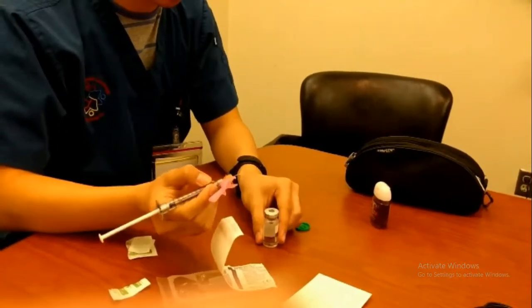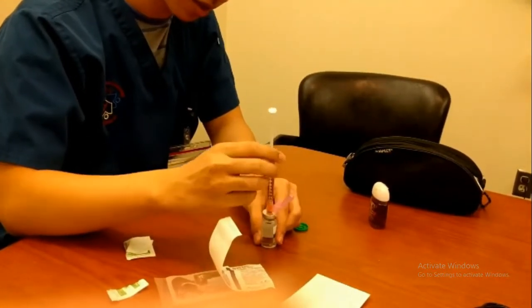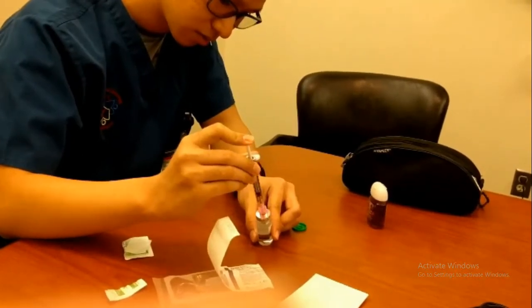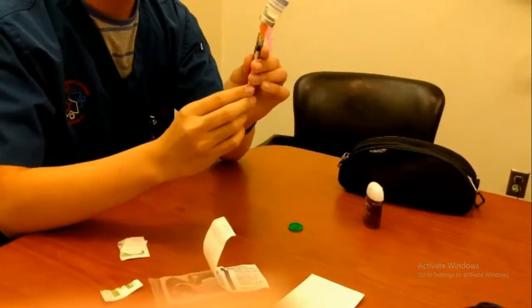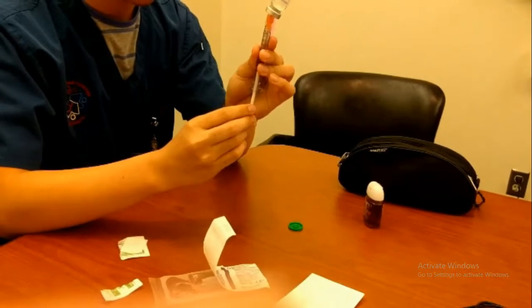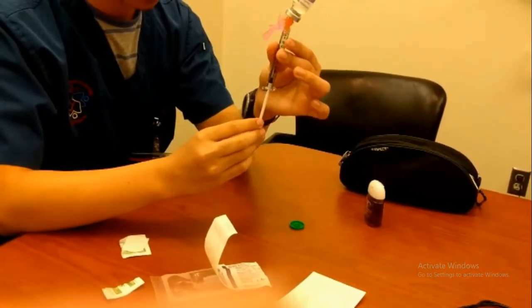And then I'll be taking it like a dart. I'll be holding the vial on the ground. I'm just going to go straight in, and then inject air into the vial, like so. I'm going to flip it over and aspirate liquid. Alright, so it's all the way up until 1.